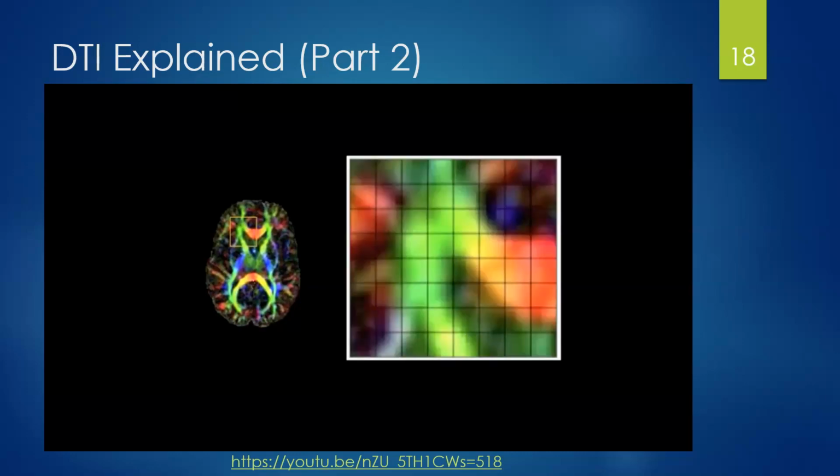Another exciting application of diffusion tensor imaging is derived from the orientation information and the assumption that the direction of greatest diffusivity is parallel to the white matter fibers in a voxel. Here we zoom in and explore the color mapping at the voxel level.